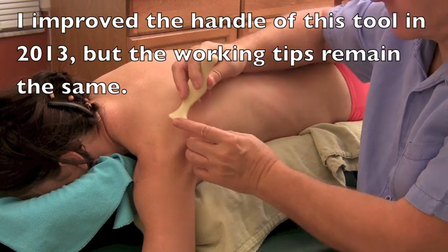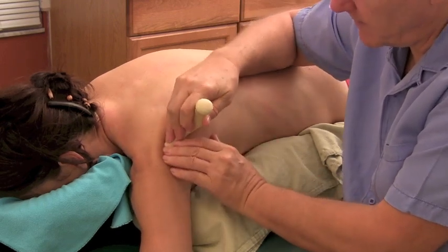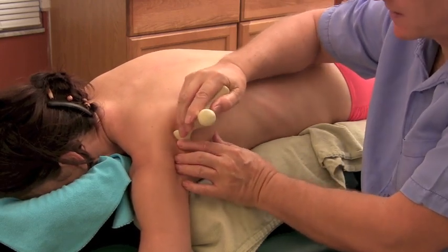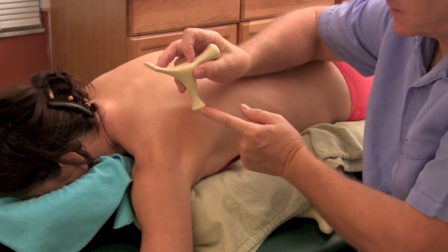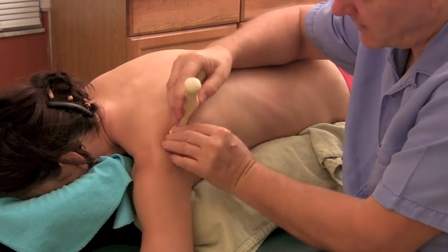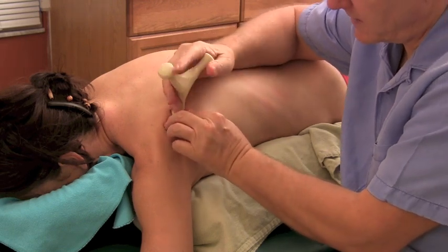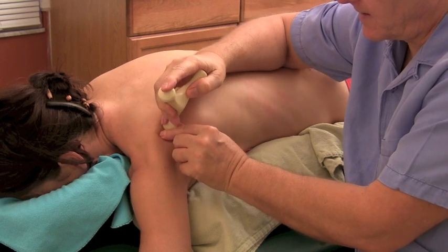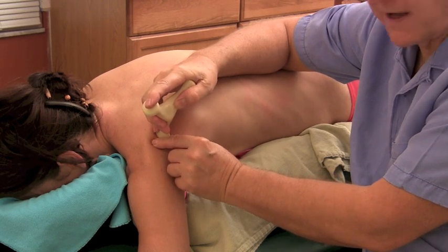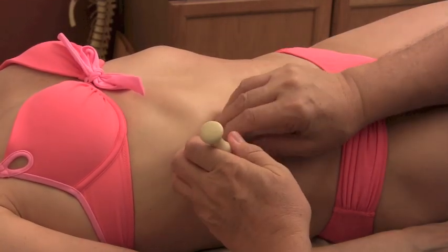I'm using the T-bar tool with this flat edge, going right along that root of the scapula. If it was a big person with a very precise trigger point, I could use that part of the T-bar and go right in, but no need for that on Kate. This pointed area on the tool — I can slip right up against her root of the scapula. There's a little area deep underneath there where trigger points will hide and constantly reactivate. It will fit right in between the ribs beautifully so you can palpate which direction they go.